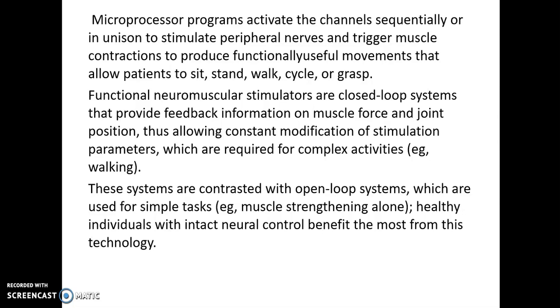Rather, if you are just strengthening a particular muscle, for example the deltoid in the upper limb, or the wrist extensors, or the quadriceps, or the hamstrings, singly alone, we can use an open loop system because it is used for a simple task, or a single task.